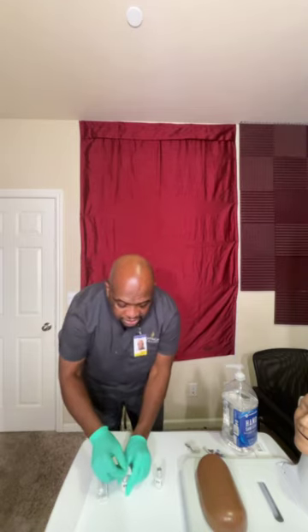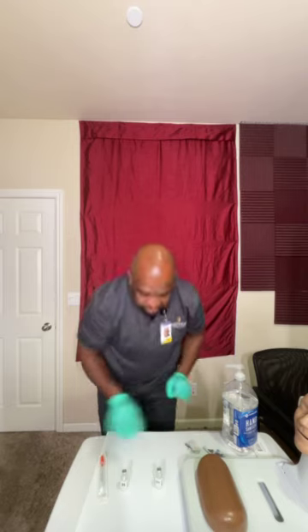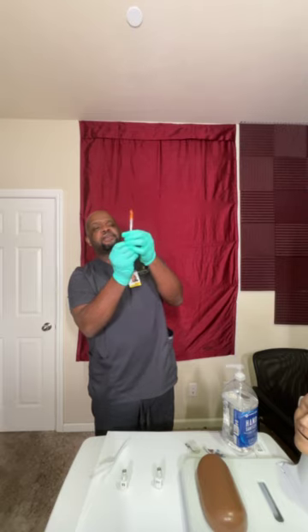Now I'm going to open up the other alcohol swab. I'm going to wipe off the top of the regular insulin. Throw that also in the trash. Now I'm going to get my insulin safety syringe, right? But the cap's still on. The top is still on. I'm going to first draw up 8 units of insulin. I'm sorry, 8 units of air.